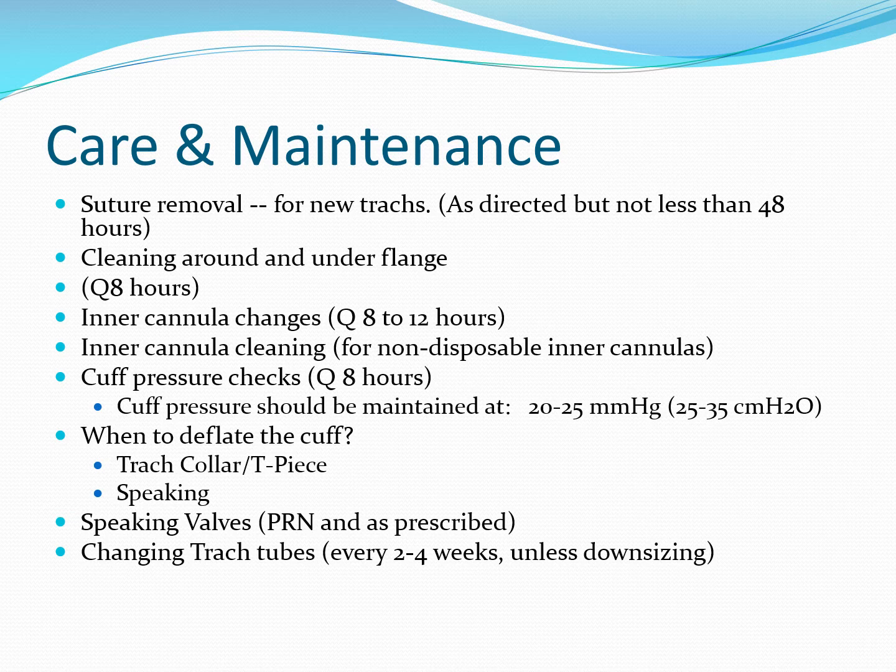There are kits available for doing that. There are also hospitals that use mouth care kits with the sponges in order to keep that site as clean as possible. This is generally done at least every 8 hours. Inner cannula changes, depending upon the hospital, happen 2 to 3 times a day or sooner if warranted, so every 8 to 12 hours. Inner cannula cleaning would be done at a similar interval, but that would be for obviously non-disposable inner cannulas. Cuff pressure checks are done at least every 8 hours, and that would be done for mechanically ventilated patients or spontaneous breathers.